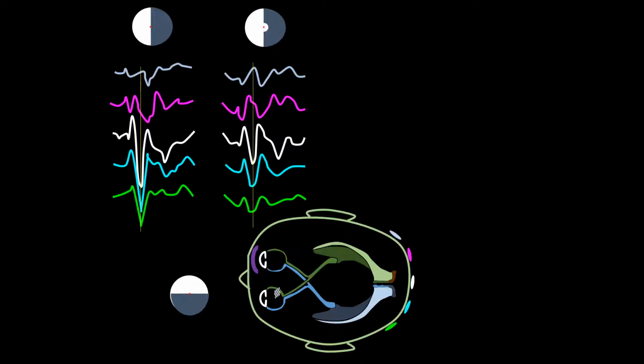I have now marked the 100 millisecond in these new waves in order to highlight the loss of the sharp configuration of the ipsilateral, parasagittal, and sagittal waves, and the clearer presence of a negative wave arising from the contralateral parasagittal electrodes. These waves, especially the one from the left temporal electrode, have a well-defined peak at 105 milliseconds.